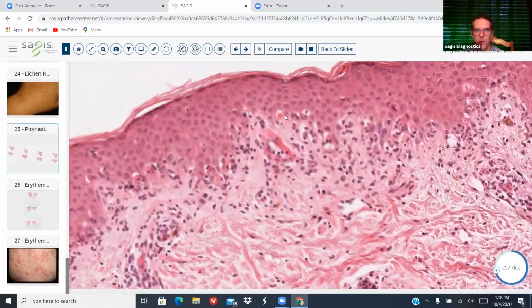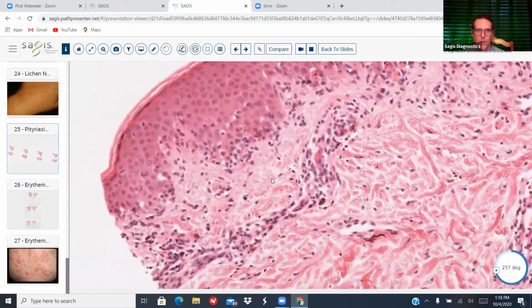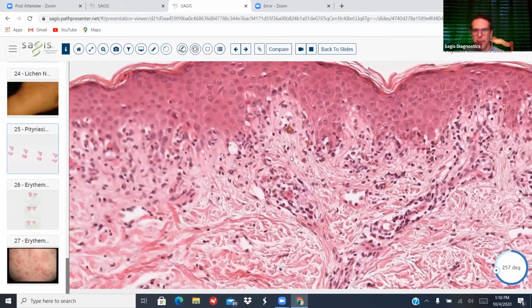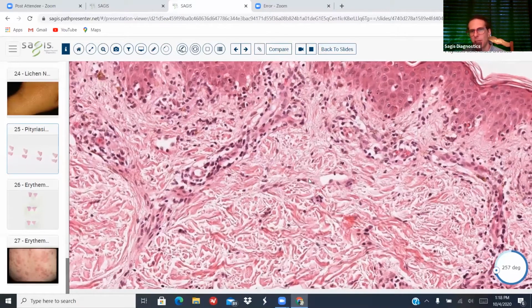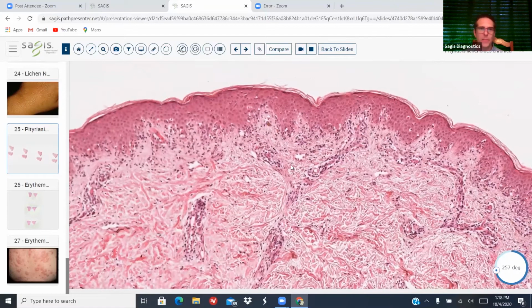We have necrotic keratinocytes, numerous necrotic keratinocytes, the vacuolar alteration. There's pigmentary incontinence. It is superficial and deep. Again, this is not very specific. I mentioned lichenoid drug eruption earlier, but just regular. There's so many different types of drug eruptions, as you know, clinically, and they all can have a component of interface dermatitis. So this should be a drug eruption itself.